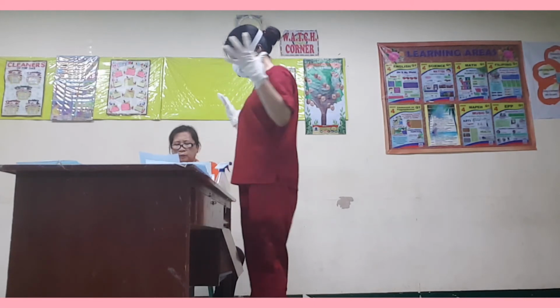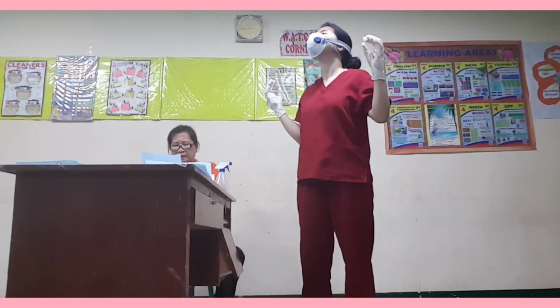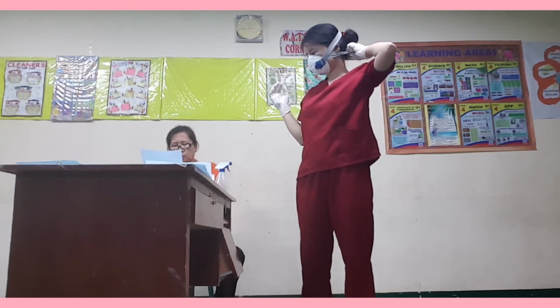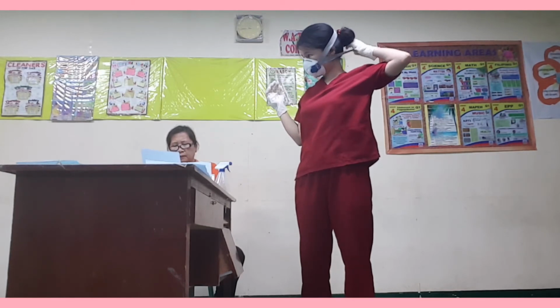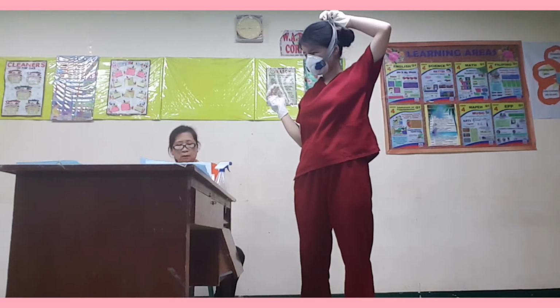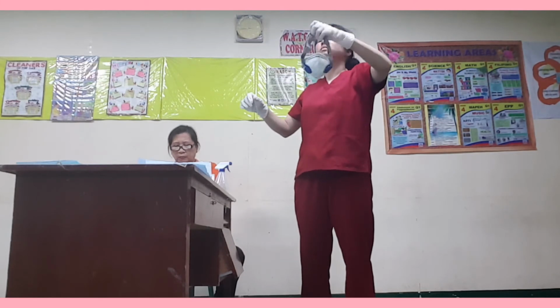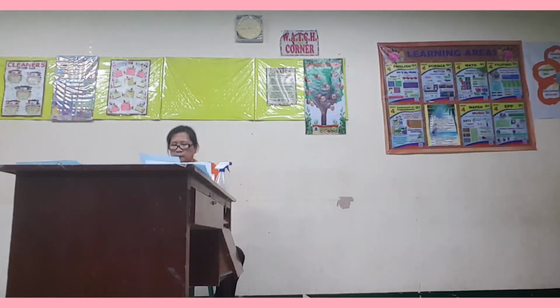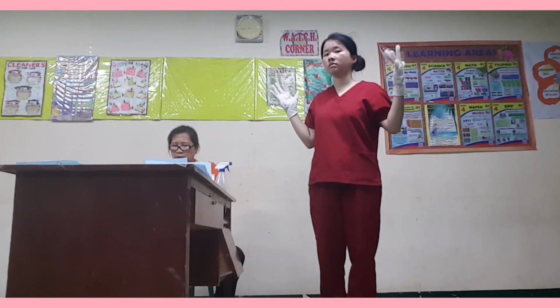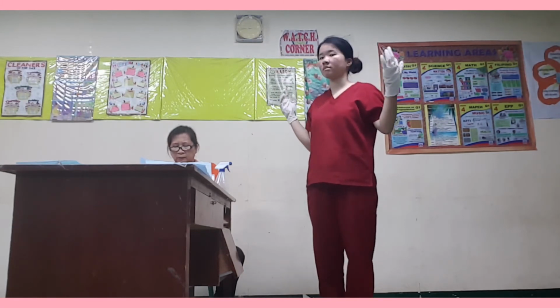Procedure number 17. Remove the N95 respirator. Tilt the head slightly forward. First, grab the bottom elastic strap and then grab the top tie or elastic strap. Remove without touching the front of the N95 respirator. Discard the N95 respirator. This prevents the top part of the mask from falling onto the chest. The front of the mask, through which the medical worker has been breathing, is contaminated.